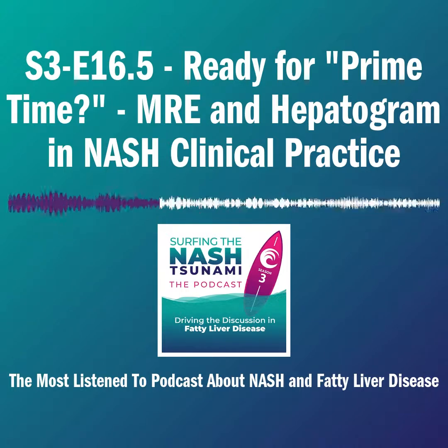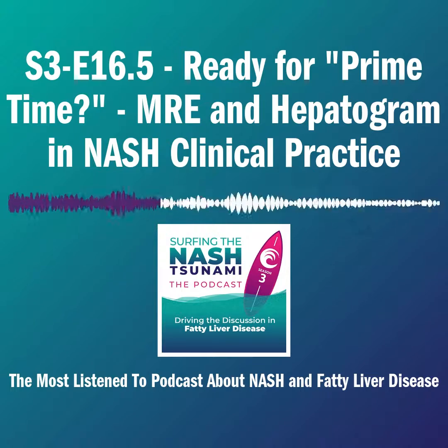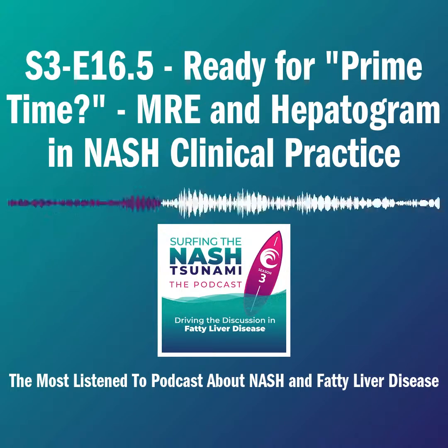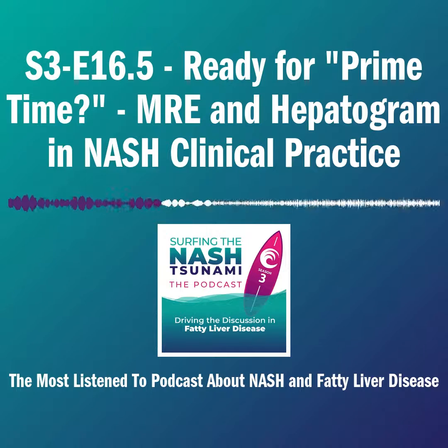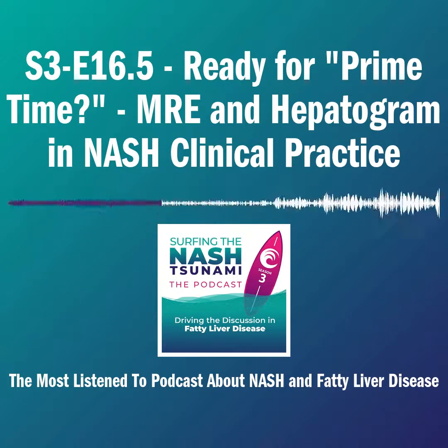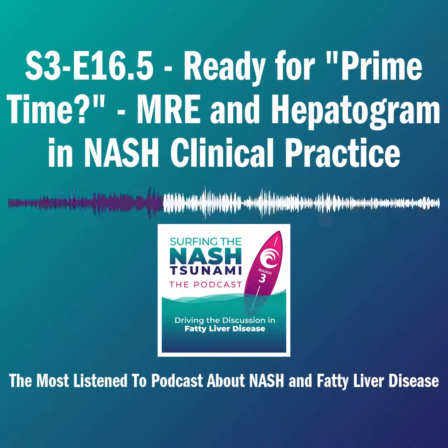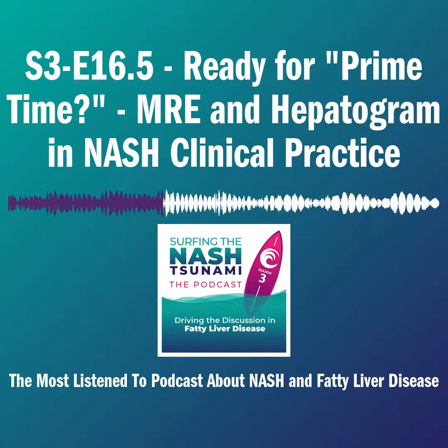And then finally, the other major protocol where we're using it is part of liver donor workups. We have a well-established liver transplant program at Wisconsin, and we've been having increasing reliance on liver donors. And just given the prevalence of NAFLD NASH, we would like to be able to identify those patients without even having to do a biopsy if necessary. And if there's a question, the patients will go to biopsy if they do proceed for partial hepatectomy for donation. But that's been another major application.